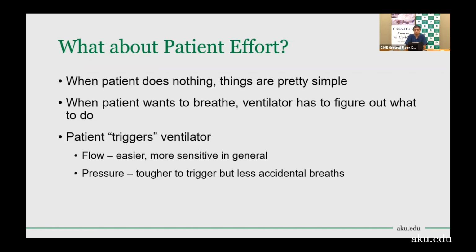So when the patient wakes up, the patient will want to breathe and the ventilator has to figure out what to do. Now we come to what is known as the patient triggering the ventilator. I'm sure all of us know what a trigger is. With flow triggers, it's easier and more sensitive in general, and pressure triggers are tougher to trigger, but fewer accidental breaths are present. When I say trigger, I mean the trigger on a gun. So the patient is going to make an effort of some sort.